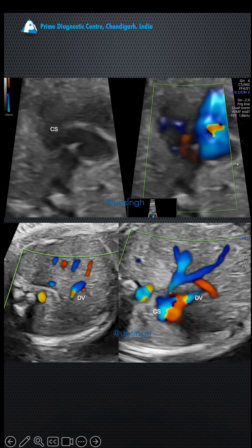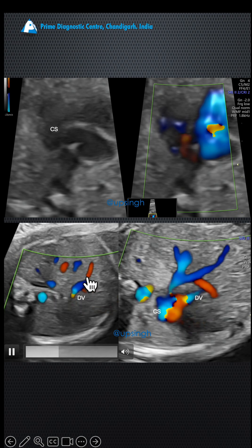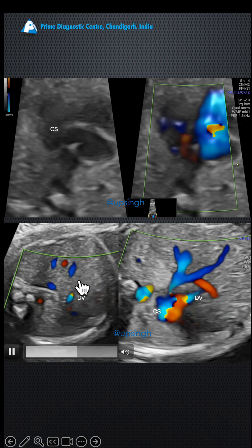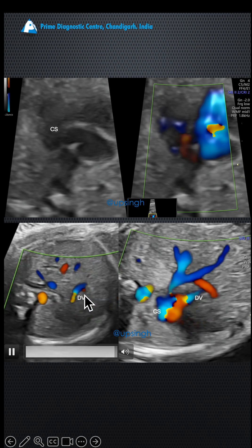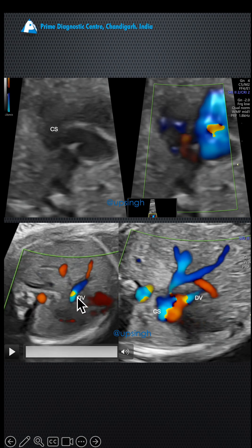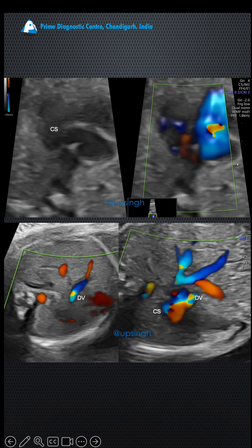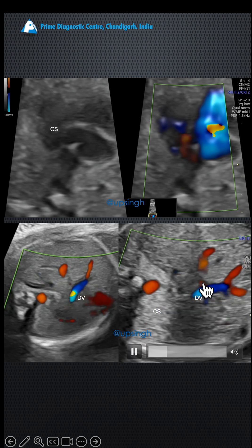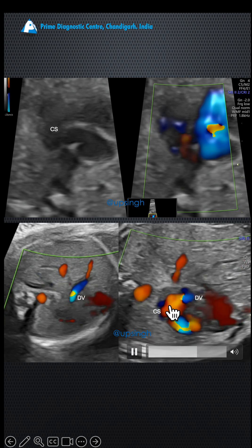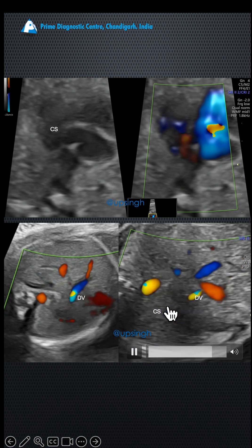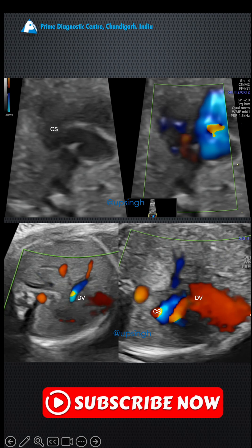We then looked at the abdomen on color Doppler. That is the ductus venosus (DV) — you can see the ductus venosus flow there. And then we noticed the ductus venosus appeared to be entering into this coronary sinus.